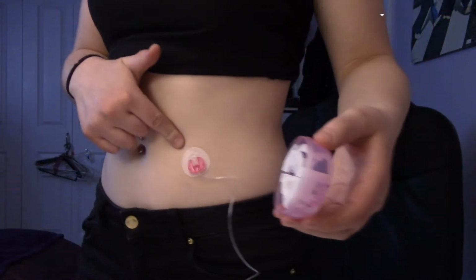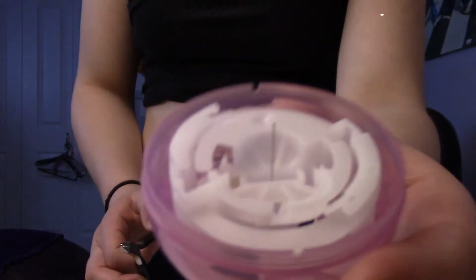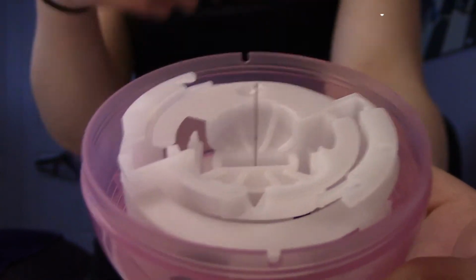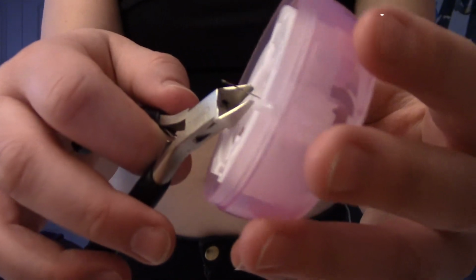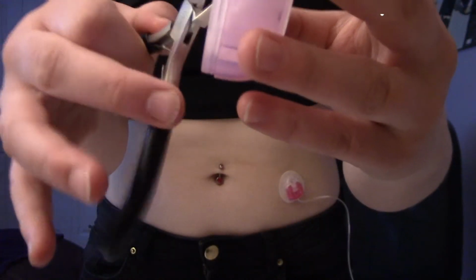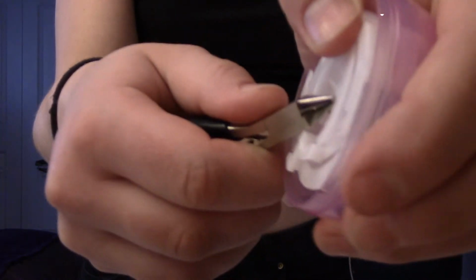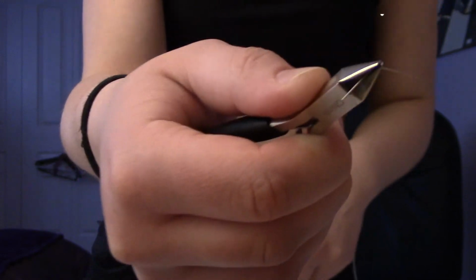Awesome. It's now on my stomach. That didn't hurt at all. What I like to do next is I like to get rid of that little needle there. And I throw that in my sharps box, and then I can just recycle the rest of the plastic. So I use my little pliers, take it, just be careful you don't break it so it doesn't fly across the room. I've had that happen to me many times. And I just pull it out. And there it is, I'm going to put that in my sharps box.